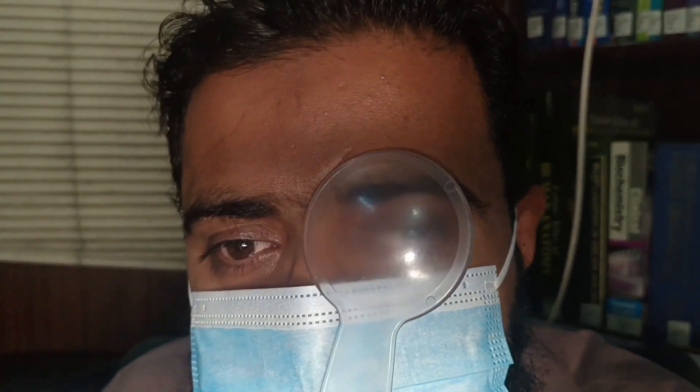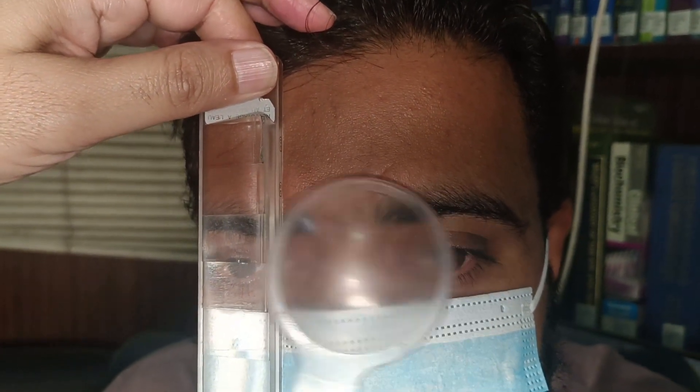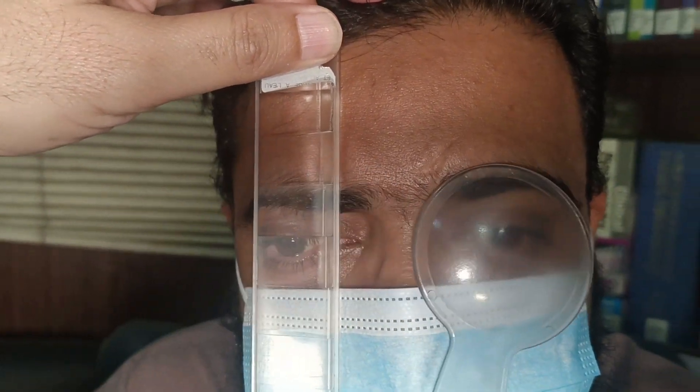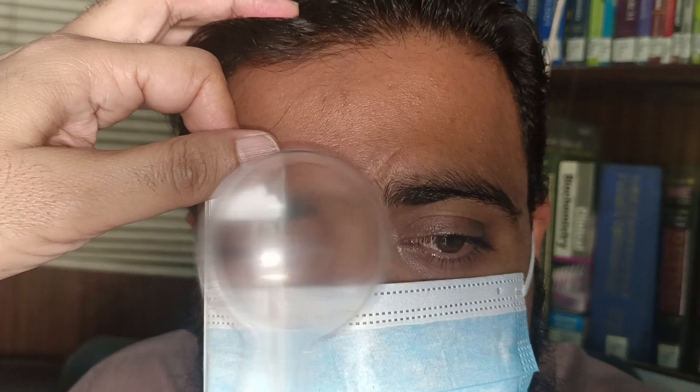We have a fixating target at half an arm's length — look at the numbers on the pencil tip. We're going to do the same cover test and see the eye movement for near. He holds it and this is a freely alternating exotropia for near in this instance. Now I'm going to put the prism bar on and see the movement. You can do it on the deviating or non-deviating eye, and you need to hold it and move — do it fairly quickly if you also want to track for fusion.